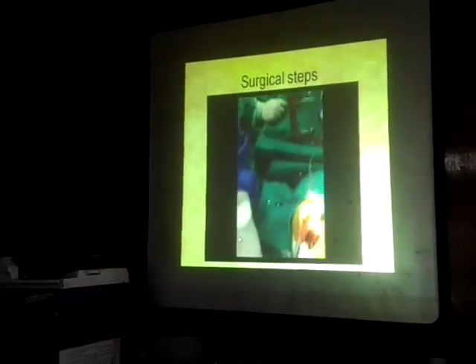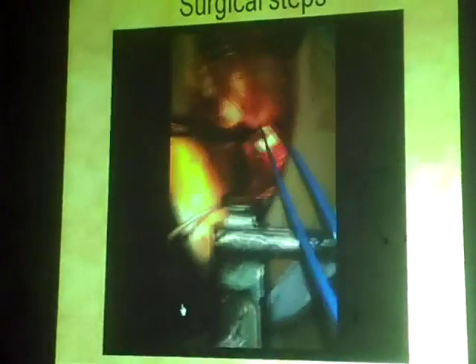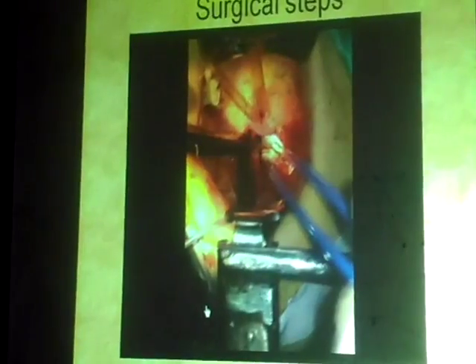So I'm going to remove the adenoid gauze back, and I will hold 2 instruments. I will hold an artery forceps with a sponge in my hand, and in the other hand I'm going to hold my bipolar forceps, so that I will clean the area using the cotton, and then the area which I suspect is bleeding, I'm going to cauterize it under vision.